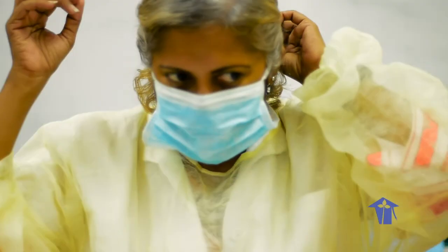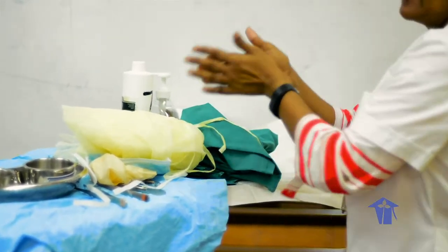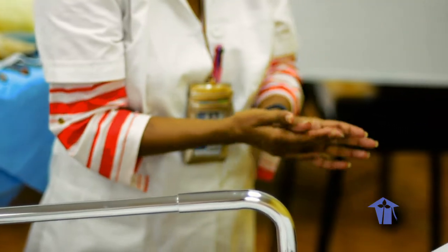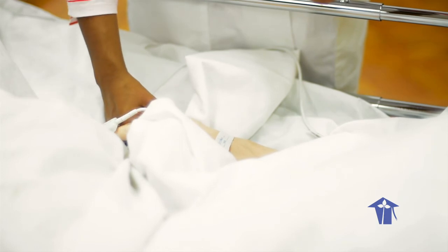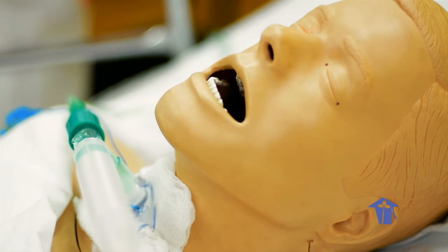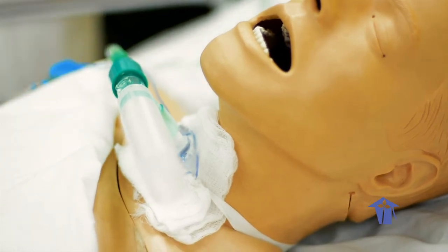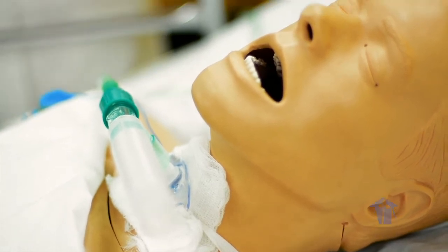We would remove our face shield, or goggles and mask, and additional PPEs, then perform hand hygiene. These are to be disposed of and sanitization done. My patient's SpO2 remains between 97 and 98. Are you having any problem, Mr. Black? Okay, no problem. Patient respiratory rate stays within normal. It's at 20. There's no pursed lip breathing, no use of accessory muscles, and no discoloration. That is the end of tracheostomy care. Thank you.